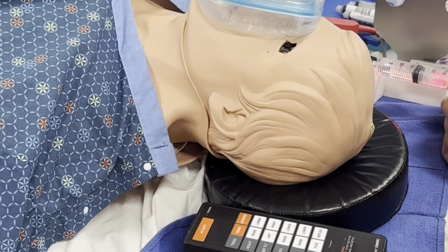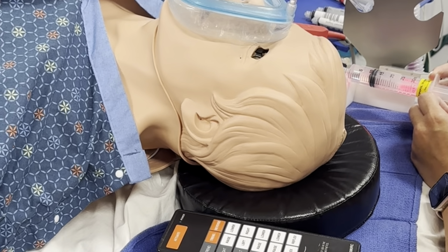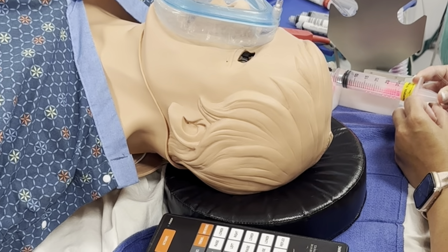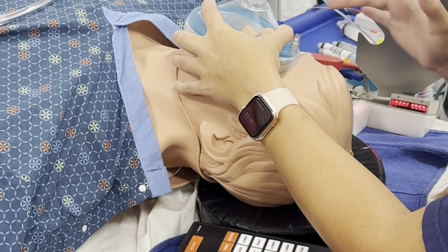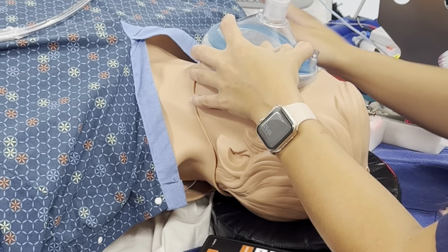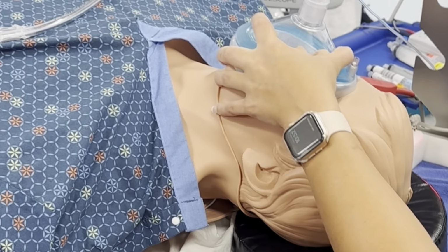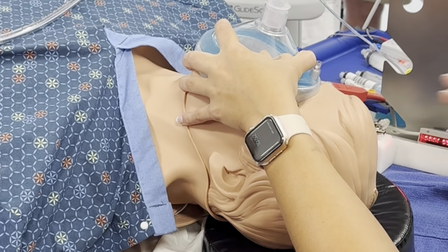And so this is where pre-oxygenation is important because after this bolus of propofol, they're going to be apneic. They're not going to be breathing. Apnea means not breathing. So we're gonna make sure that they're asleep. We're gonna do an eyelash reflex. We're gonna make sure their eyelashes won't move when you touch them. And then you can also ask the patient how they're feeling, and if they don't respond to you, you know they're asleep. So then we're going to breathe for the patient because at this point they're not breathing.